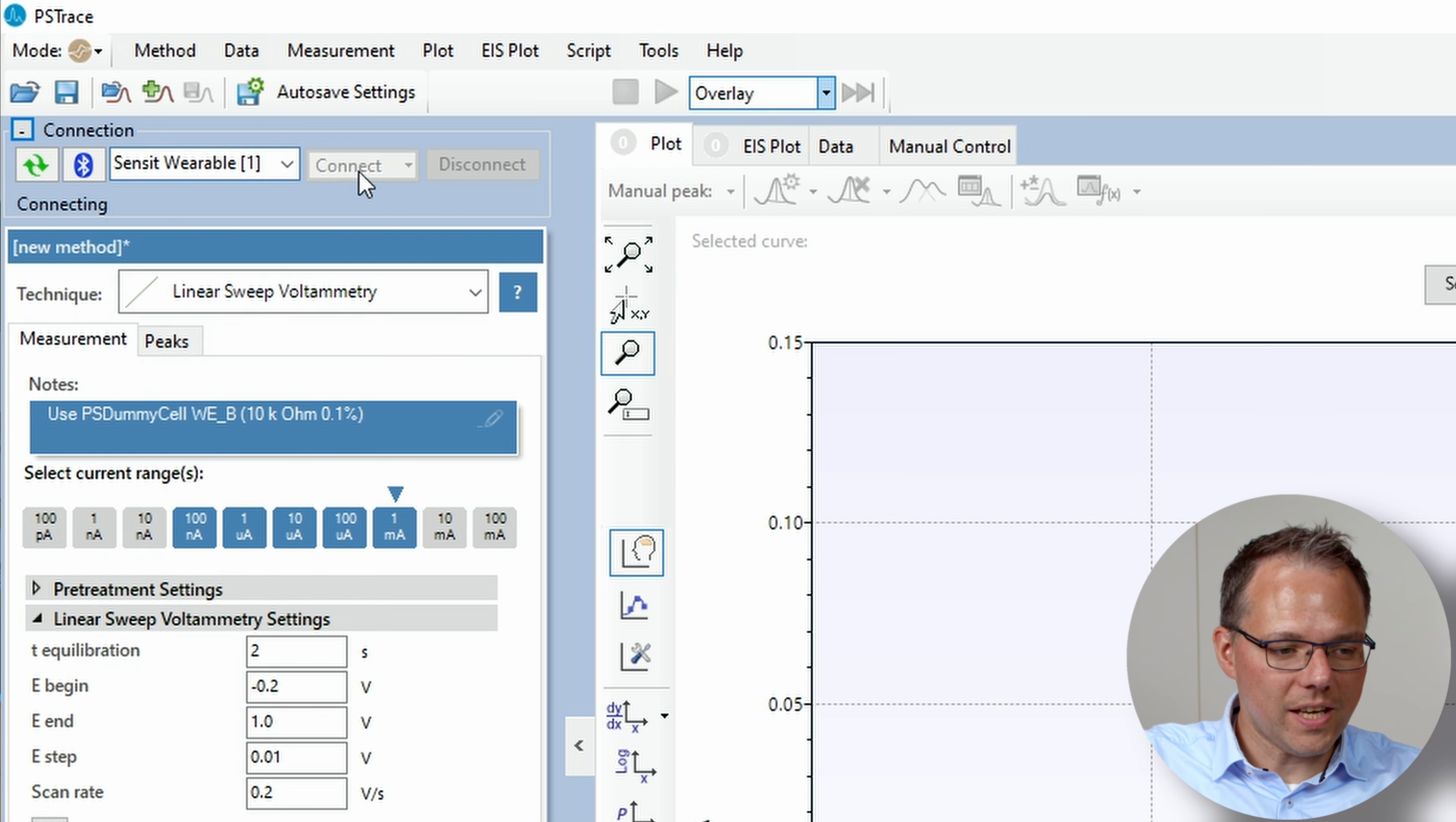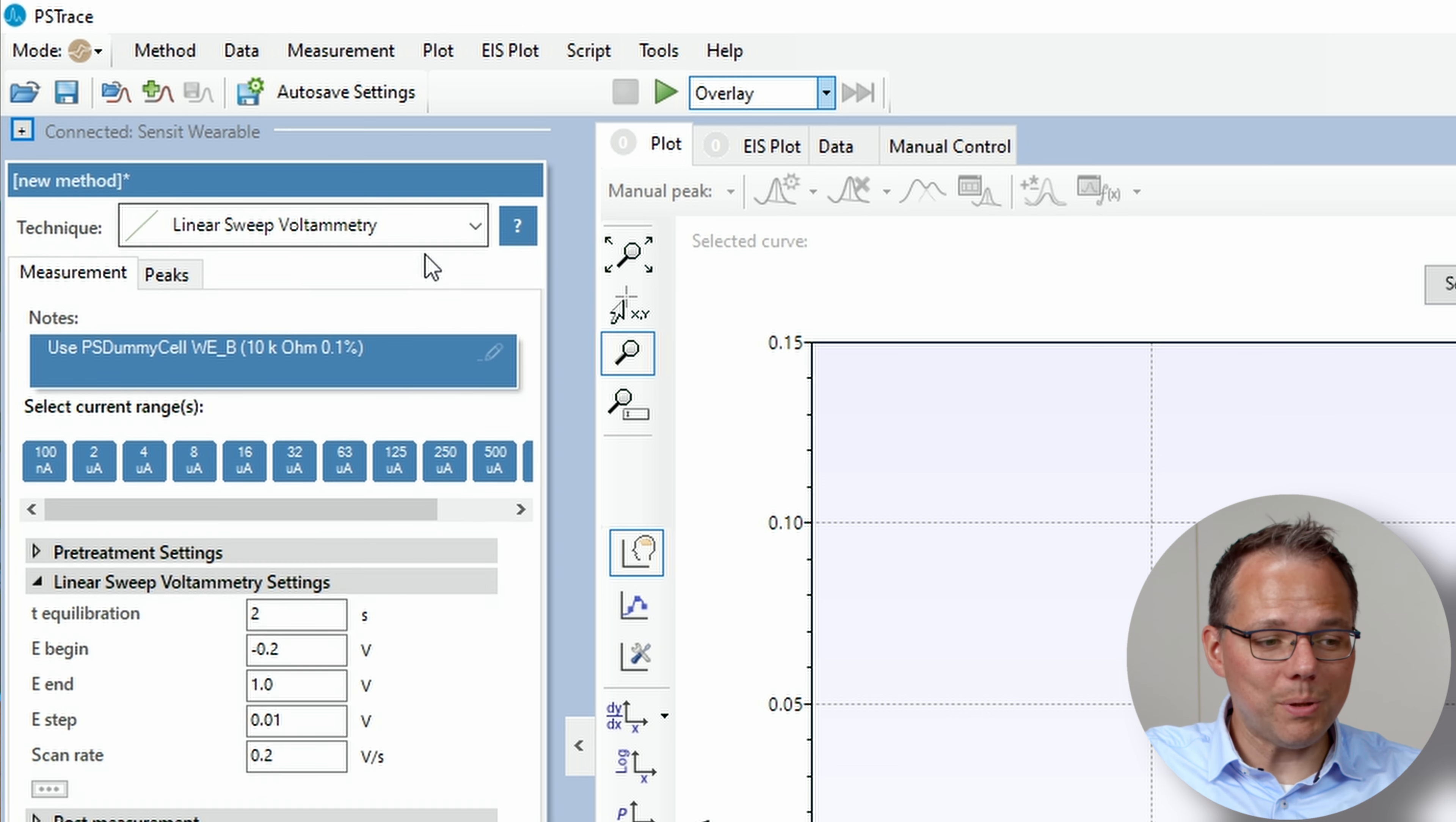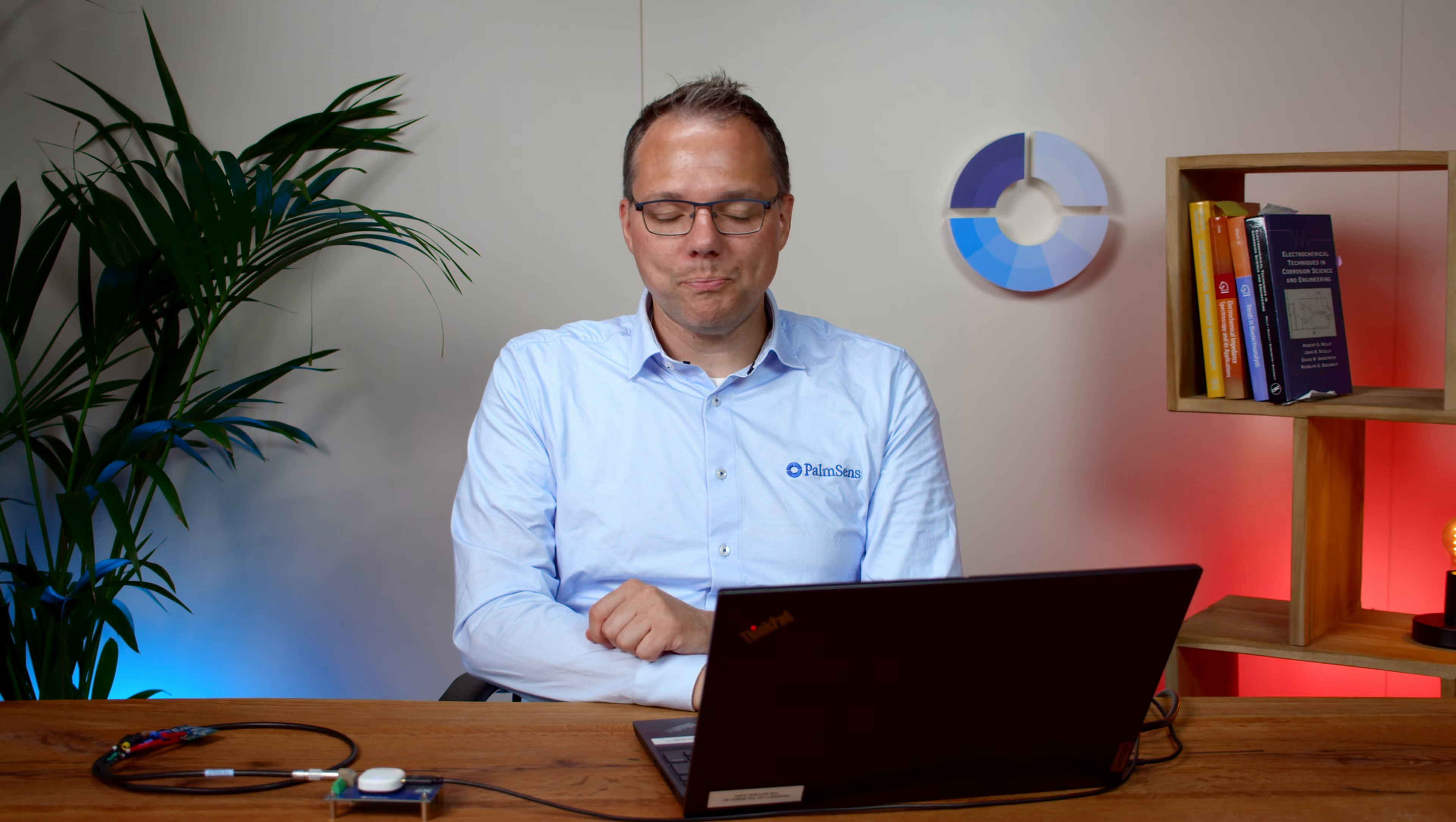Then you just connect to the Sensit wearable and for this test measurement I have chosen a really simple linear sweep voltammetry because now it's not about high performance measurements but I want to show you how to get a script on the Sensit wearable.